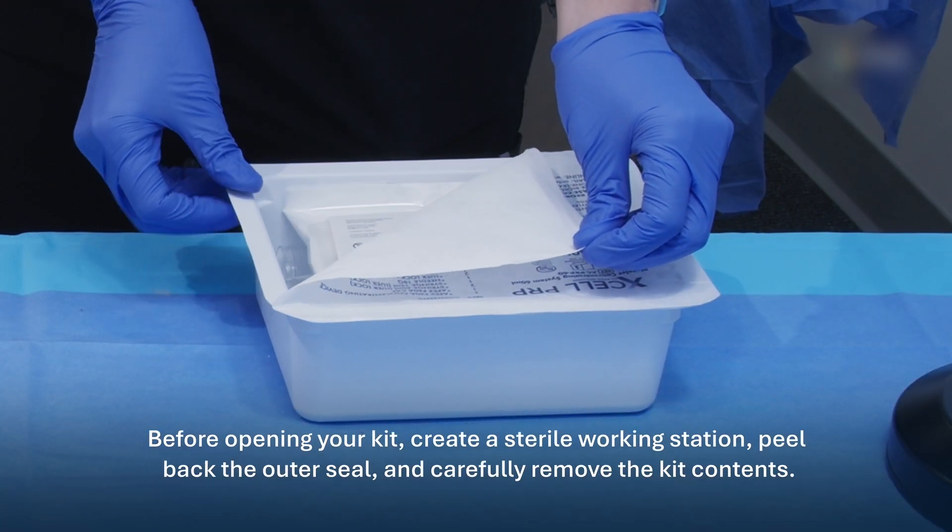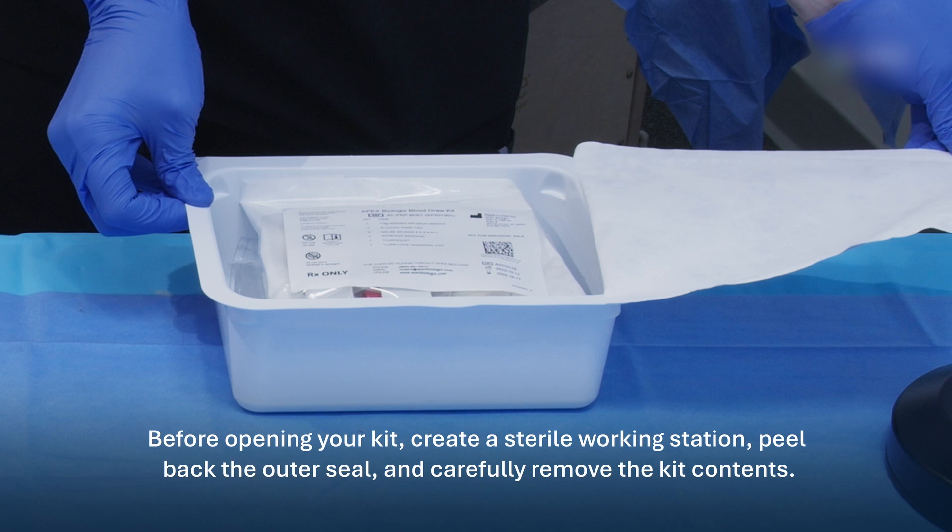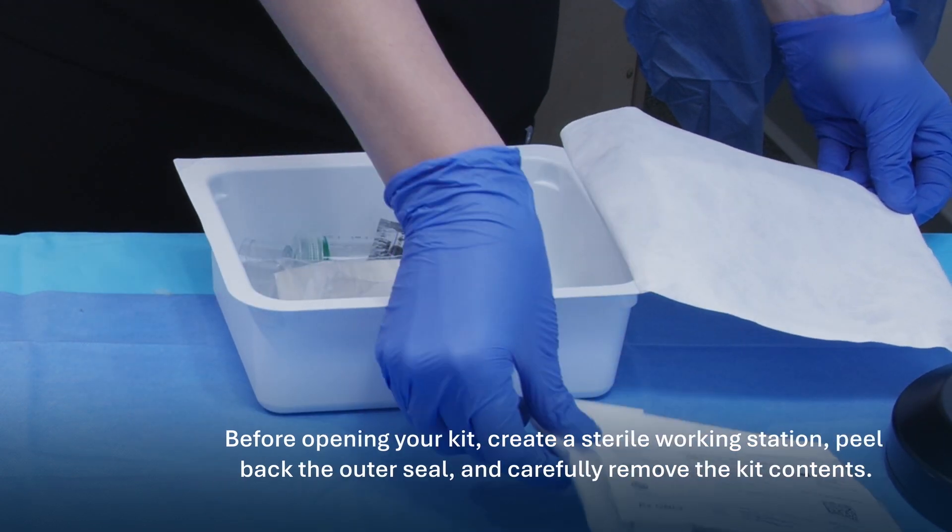Before opening your kit, create a sterile working station, peel back the outer seal, and carefully remove the kit contents.